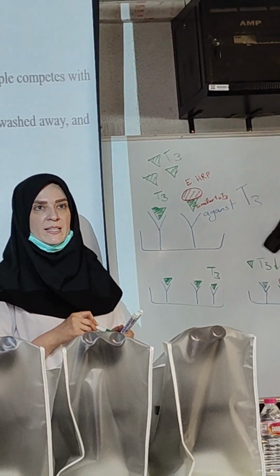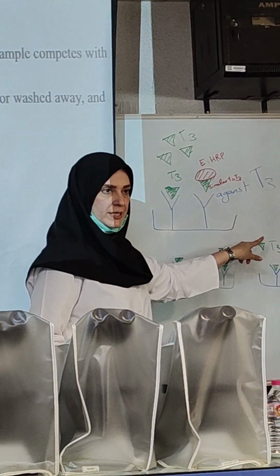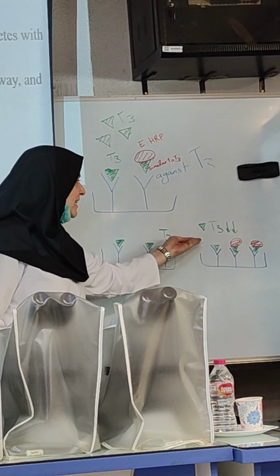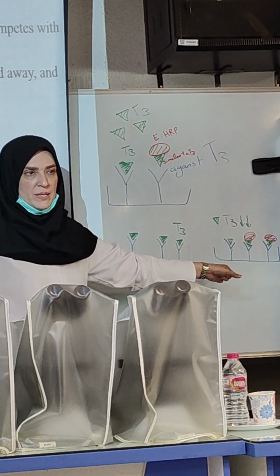Pay attention. In the case of hypothyroidism, because the concentration is very low, they cannot bind and they cannot win during this competition.